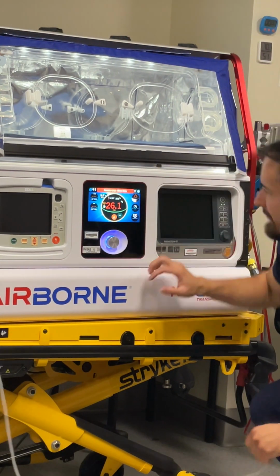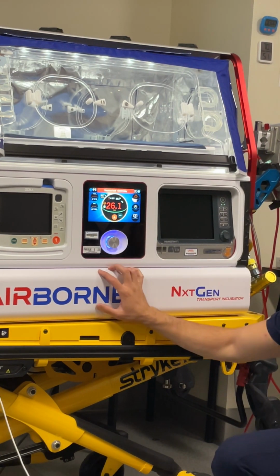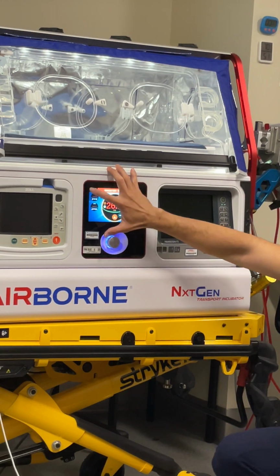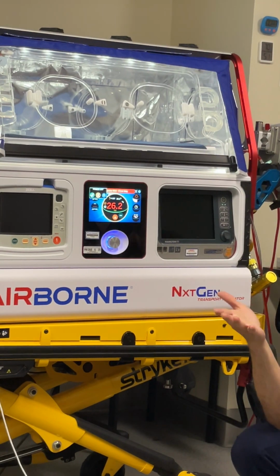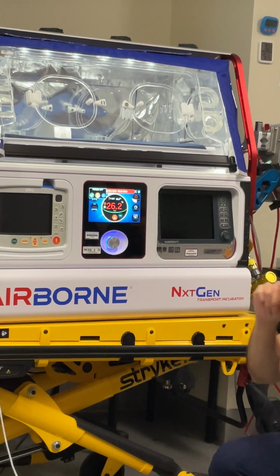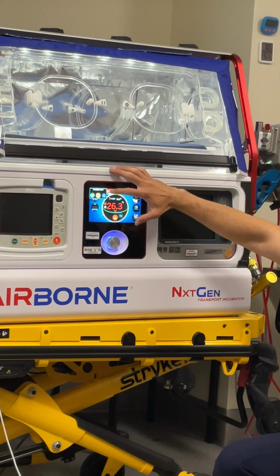Okay, all right. Does anyone have any questions on this? Because we're pretty much done. I'll just show you how to get back to the screen. I encourage you guys to come up and touch it, because it's a lighter touch than you think. So we go back into preheat mode.